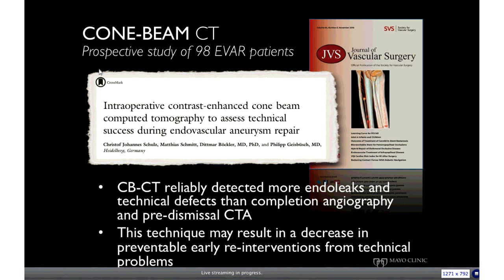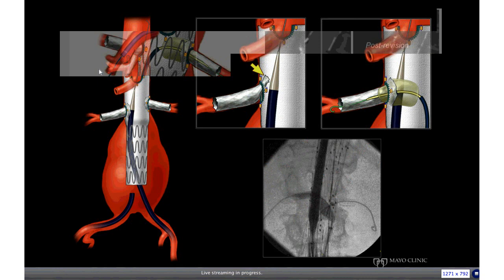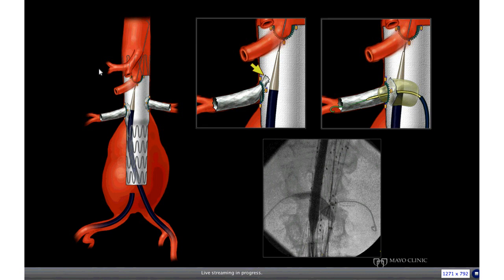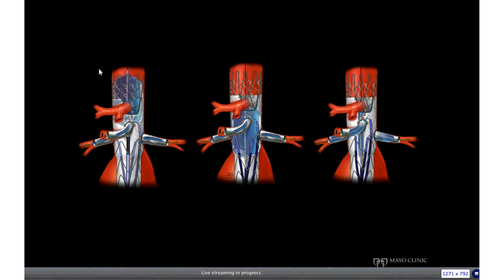Here are examples where problems could be easily identified with cone-beam CT. With a fenestrated graft, the bridging stent must be assessed to confirm it is adequately positioned — not too far inside a vessel or too far outside, and not compressed. Compression can occur when placing iliac limbs, as the tip of the delivery system may squish the stent against the aortic wall. In one patient without a cone-beam CT performed, we found complete infolding of the sealing stent early after the operation. Fortunately we were able to re-expand the stent, and a cone-beam CT confirmed full expansion.